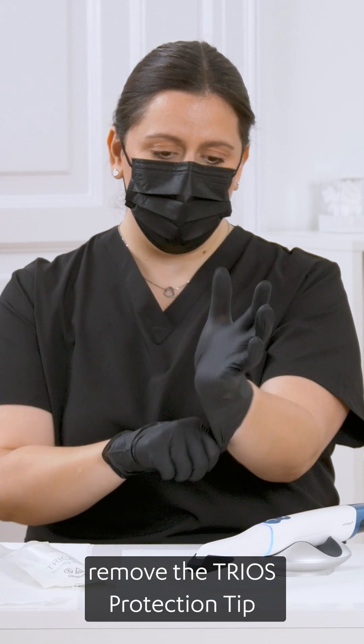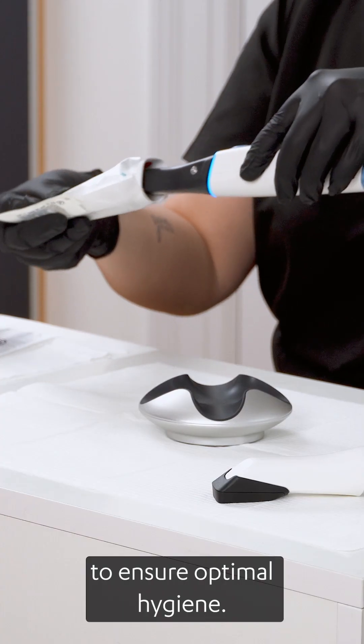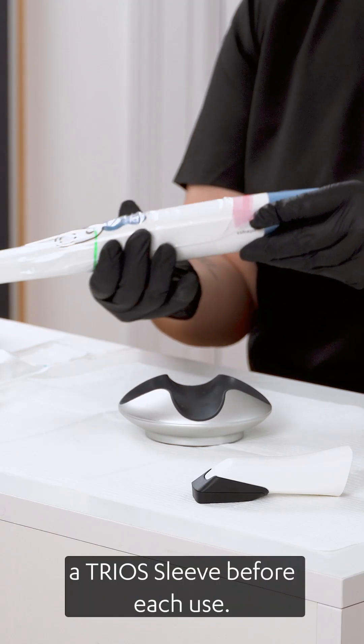Before scanning, remove the TRIOS protection tip while wearing gloves. Then attach a TRIOS Ready tip to ensure optimal hygiene. To avoid cross-contamination between patients, you must also apply a TRIOS sleeve before each use.